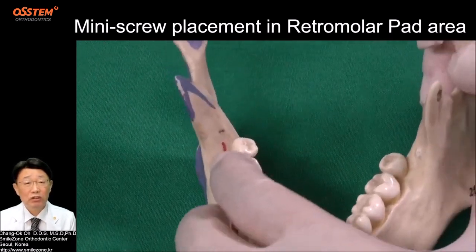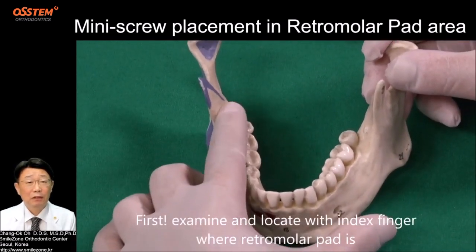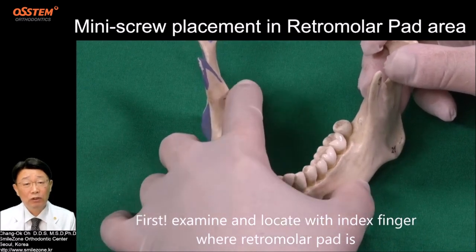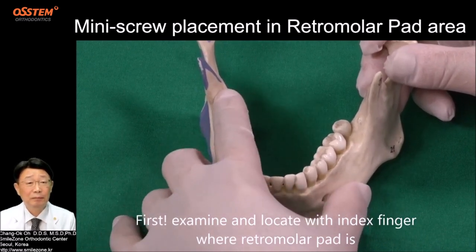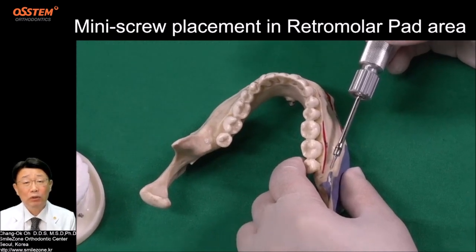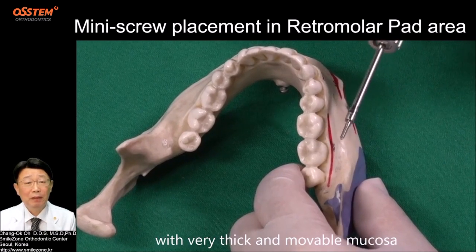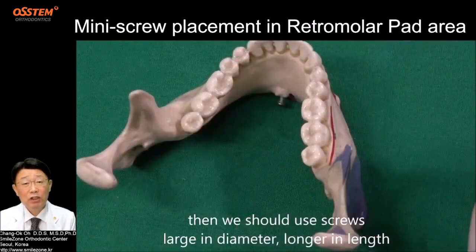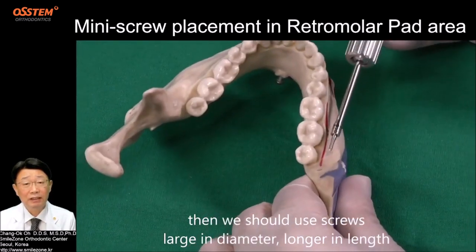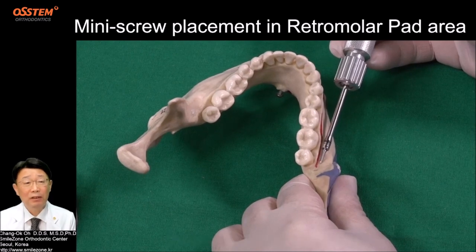After local injection, to find the right location, first examine and locate with index finger where retromolar pad is. Keep in mind, thick and dense cortical bone with very thick and movable mucosa. And then we should use screws large in diameter, longer in length. The larger and longer is the better.